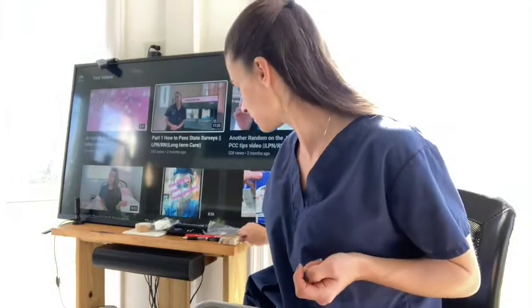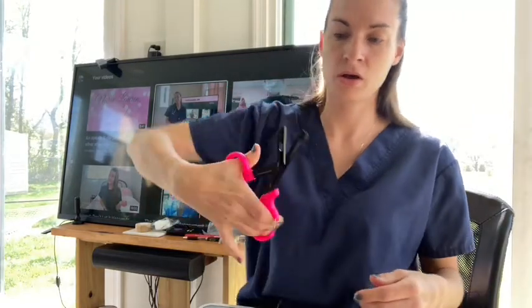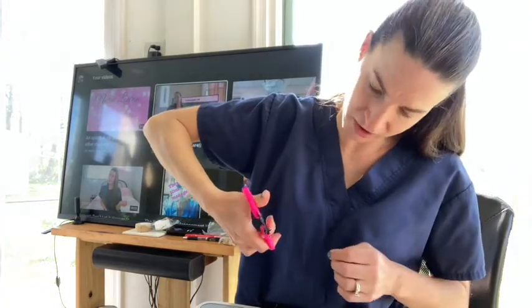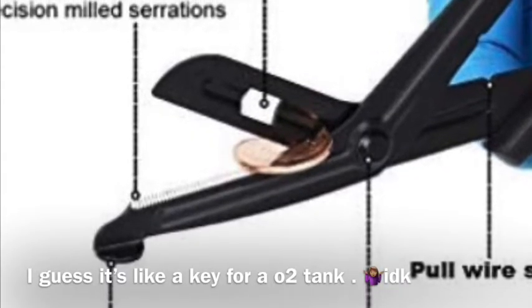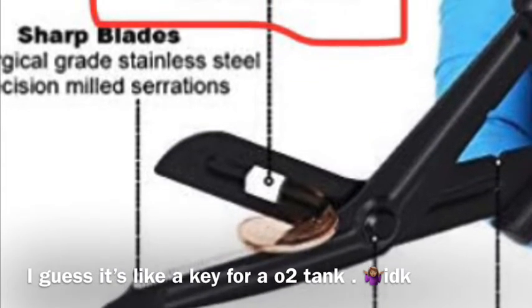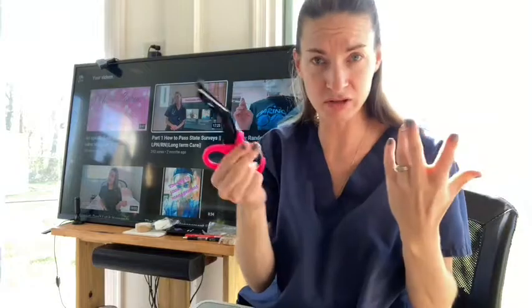It comes with a pair of scissors, which are huge. I lost mine at work so that's right on time. There's also this hole — I don't know what it's for — you can clip it onto something in your bag, whatever, just to keep it in one spot.